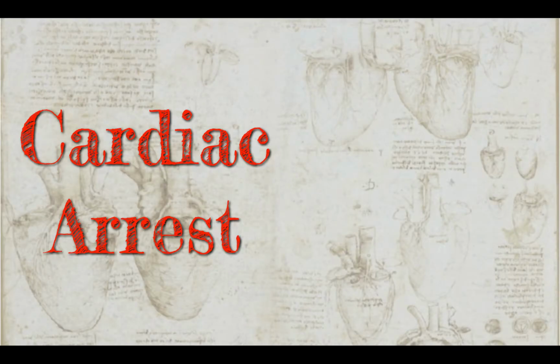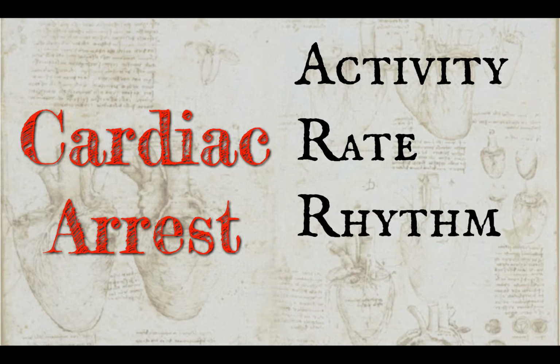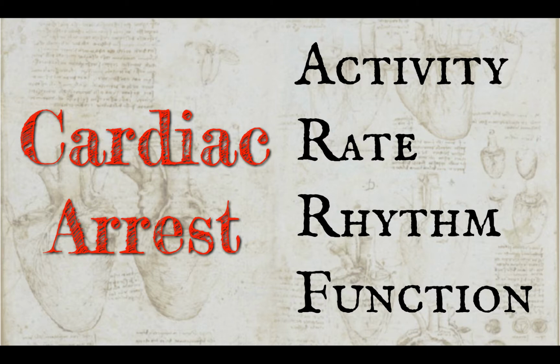Alright, so primitive ambu bag aside, what do we do in cardiac arrest? There's going to be 4 things that I want you to be looking for when you're ultrasounding a patient in cardiac arrest. First, ask yourself, is there cardiac activity? Next, ask yourself, what is the mechanical rate? And what is the mechanical rhythm as compared to the electrical rhythm? And finally, ask what the function is. How well is that mechanical pump doing?